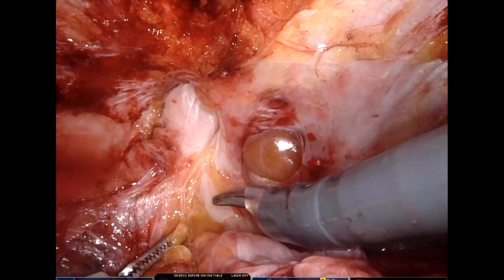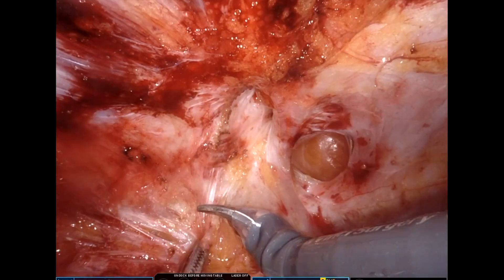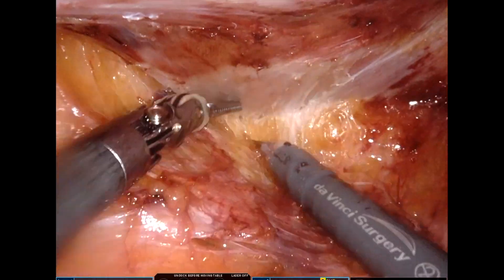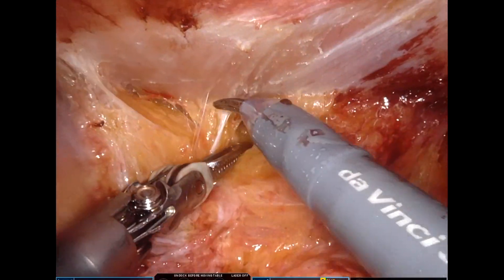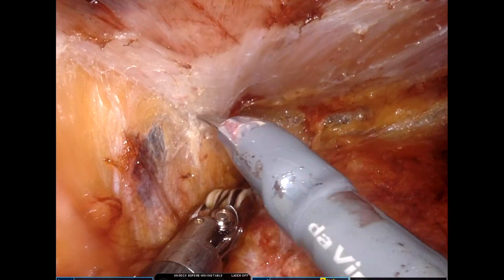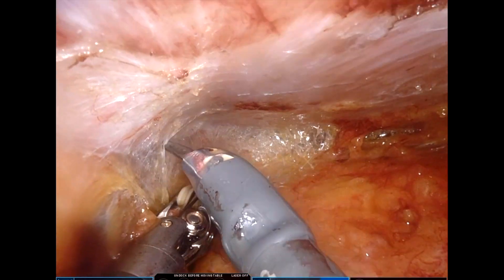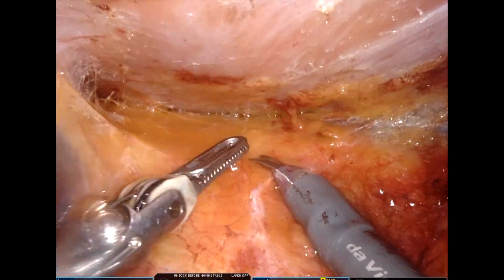All this dissection is being done with the camera in the 30-degree up position. Switching the camera to 30-degree down becomes helpful in dissection beyond this point. Throughout the surgery, the common steps we perform are: retracting tissue with the left hand, buzzing with the right, and then pushing — so it's retract, buzz, push — and swimming maneuvers whenever required.